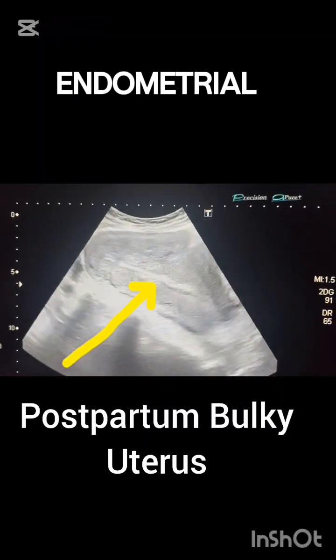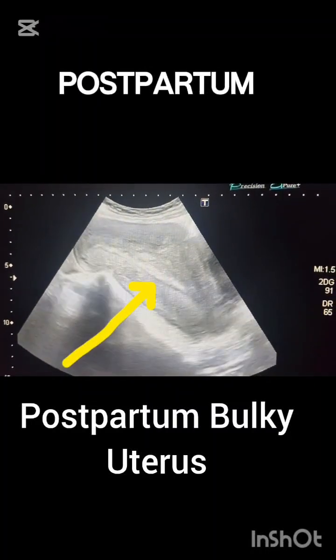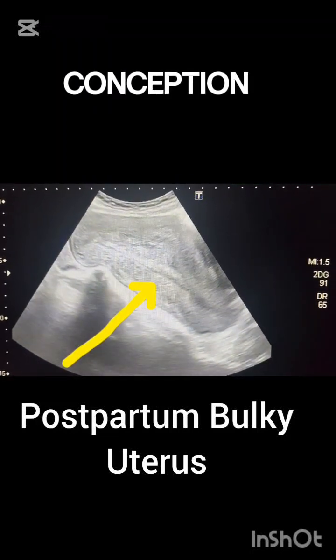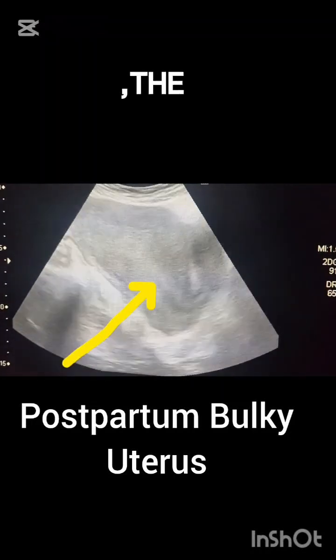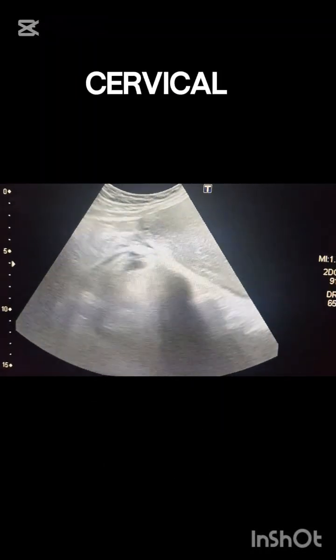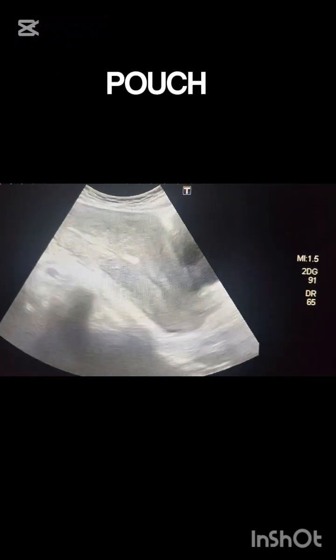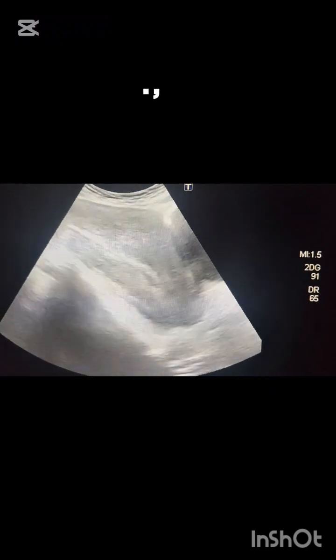The endometrial cavity is centrally located, with normal thickness for the postpartum phase, and no evidence of retained products of conception or abnormal echogenic material is noted. The cervix appears closed, and no significant cervical or intrauterine fluid collections are identified. The pouch of Douglas is clear, with no free fluid detected.